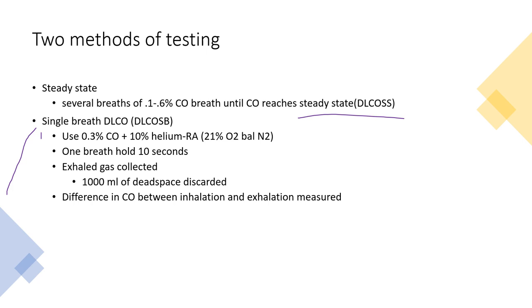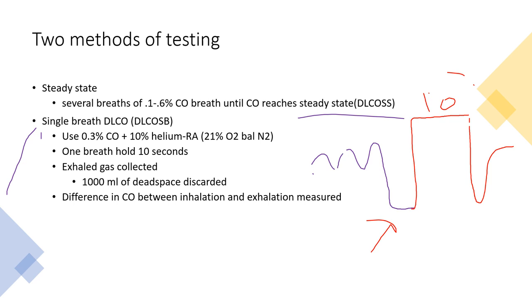We're going to have one breath hold for 10 seconds. So you're going to have them breathe normal, then you're going to have them exhale. And then once they're down here, this is where you're going to change it and give them the carbon monoxide, right? And then they take a deep breath in and they hold it for 10 seconds, and then they're going to exhale again and then back up to normal. So this is where they have that gas and they're holding it for 10 seconds.